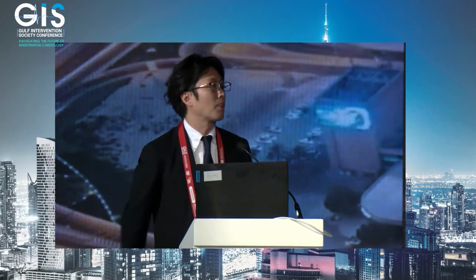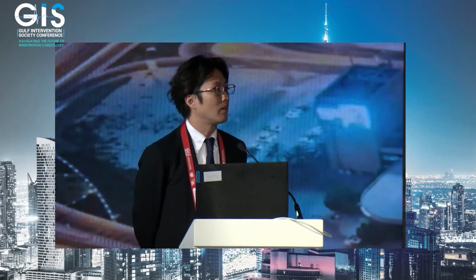Excellent presentation, showing how to use OCT in the ultimate, perfect way. Tell me, how long does it take, or how much experience do you need to be able to interpret these images? I'm thinking of a cath lab with 10 or 12 cases on. How long does it take to master this, and how long does it take for each case?